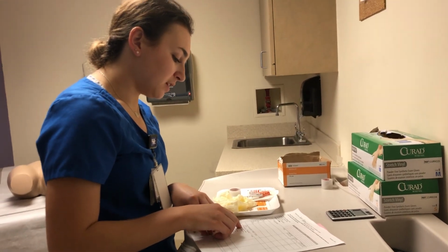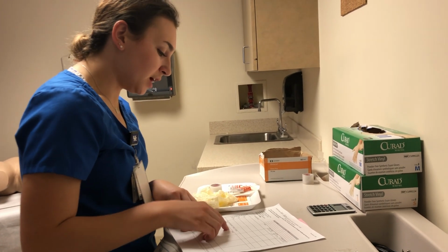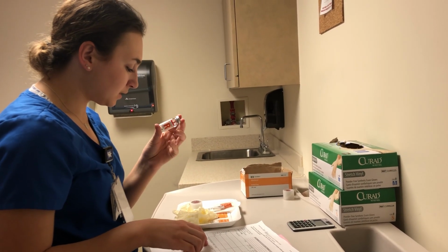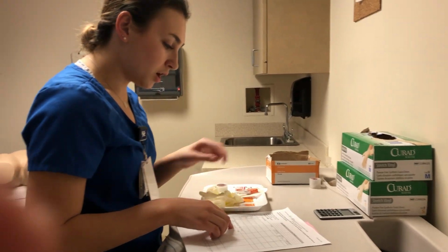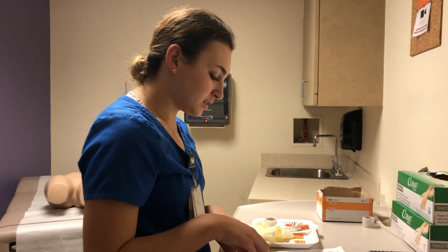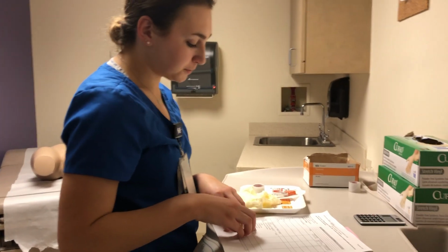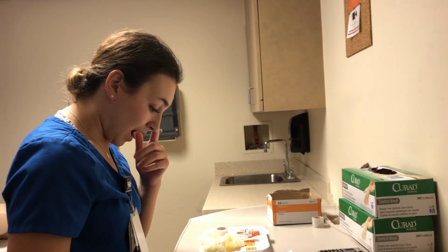I am going to be giving Novolin regular insulin 100 units per 1 milliliter. It is a PRN medication. I am checking that I have regular insulin 100 units per milliliter right here, and that is what I have. It matches. I will be administering 6 units of insulin because my patient's blood sugar is 258, and from 251 to 300, I'm supposed to administer 6 units. We will be administering this subcutaneously into the abdomen.